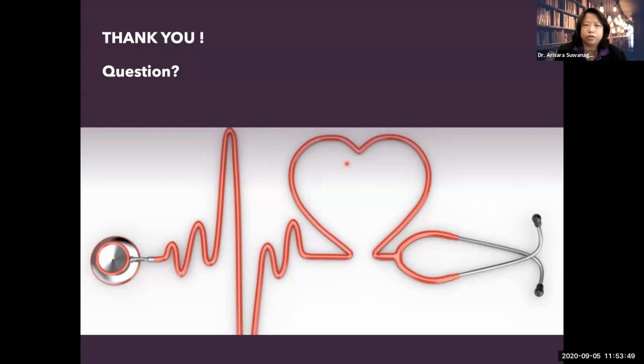For the single chamber, you don't have any atrial signal to discriminate whether it's V more than A or A more than V. So the dual chamber is going to give better discrimination if the patient has an atrial arrhythmia together with VTs. Let's say these patients have AFib or A-flutter along with their VTs. If you have only a single chamber, it's very hard to discriminate whether it's AFib with RVR or flutter 2 to 1 versus a real VT. So if you have a dual chamber, you can differentiate it with A more than V or V more than A. That's all. Other things will be the same.